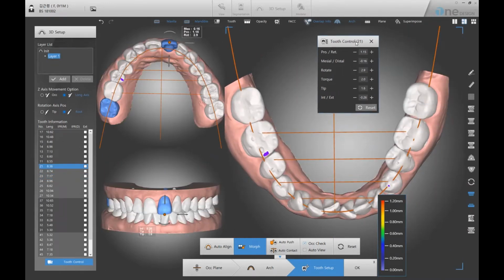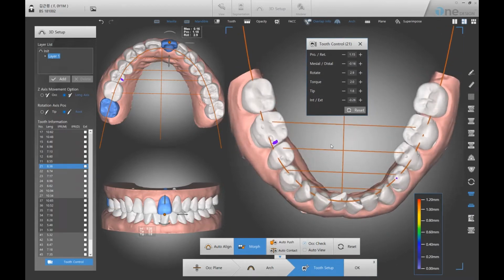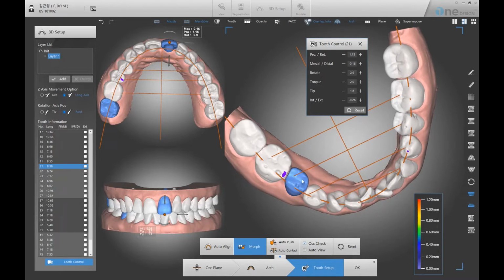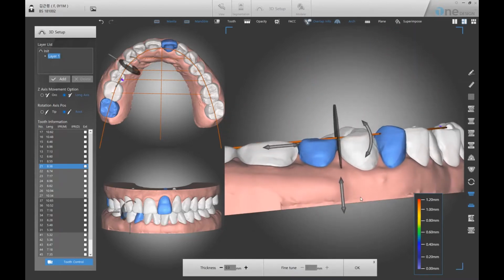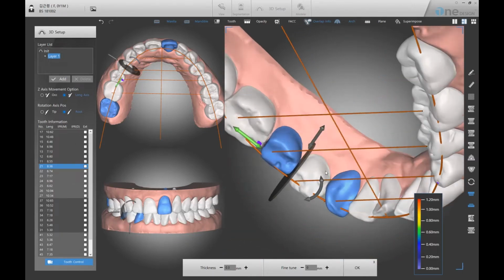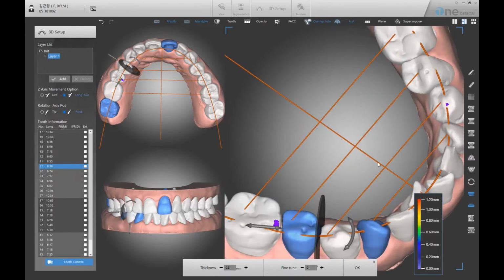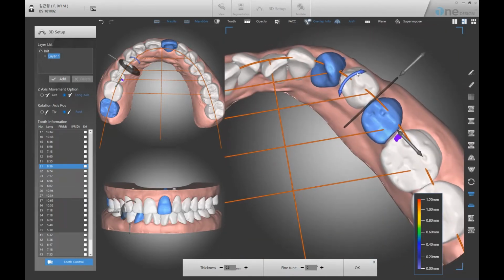We will start resolving anterior crowding by IPR between non-overlapping premolars. When applying IPR, cut parallel to the long axis of the tooth, applying it little by little, step by step, rather than applying a lot at once.